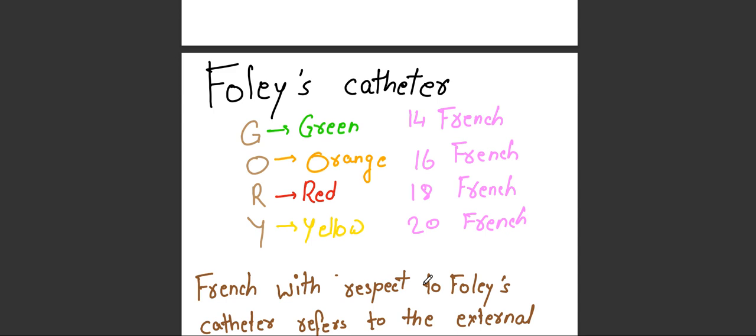And as I have told you, my mnemonic, whether it may be for the IV cannula or for the Foley's catheter, always starts from the 14 number. So for the green color it is 14 French, orange color it is 16 French, red color it is 18 French, and yellow color it is 20 French.